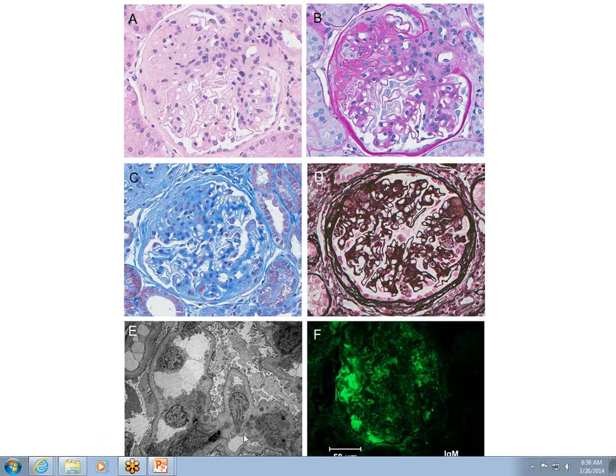Okay. So in the EM, again, we have the podocyte foot process effacement. We have these little things here, and if you all looked at this at a higher mag on your own laptop and not on this huge computer screen, there are electron-dense areas in this mesangium, but the shape of this is such that it is not consistent with immune deposits. If you were to say that there's electron-dense material in the mesangium, that would be fine.